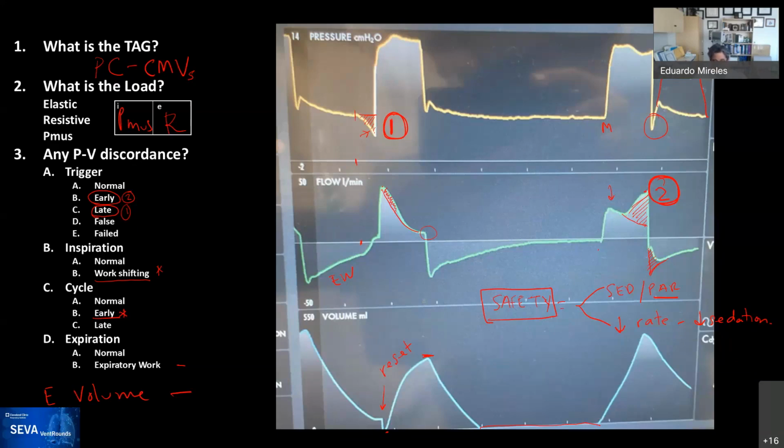Now, this is an evolving field. I'm going to make that very clear. This is an evolving field, and we are still trying to figure it out. But based on the clinical observations of the last 2 years, I think that this is more related to sedation than to something else, and it's driven by our aim to control the asynchrony process and the tidal volume in patients with severe ARDS, and as they are emerging, you start seeing these mechanisms.